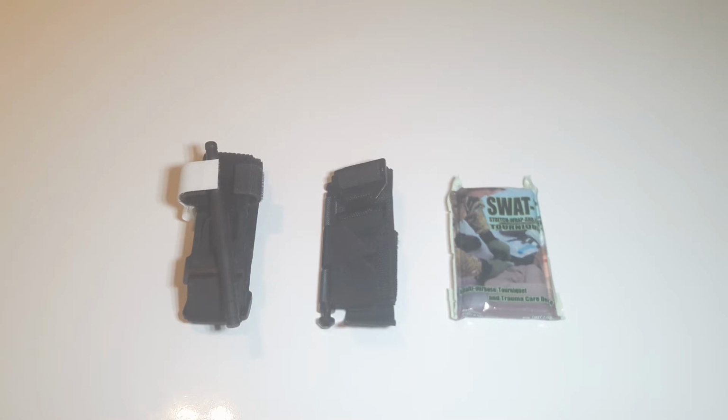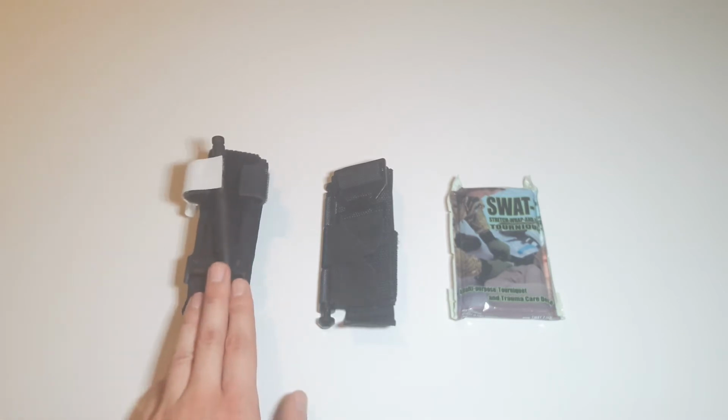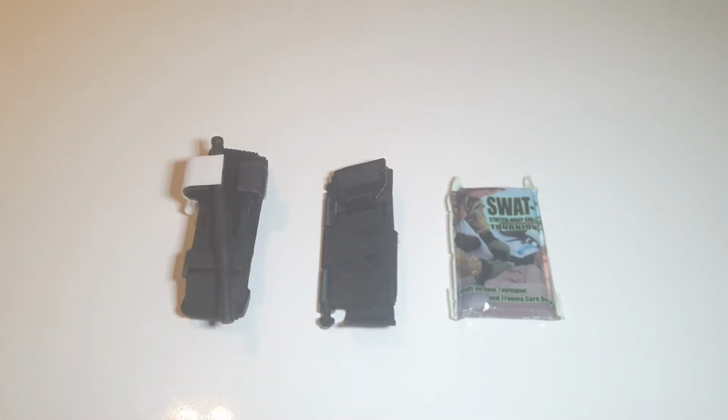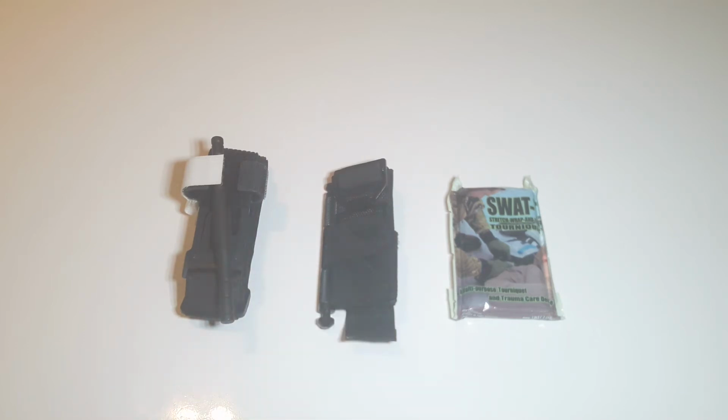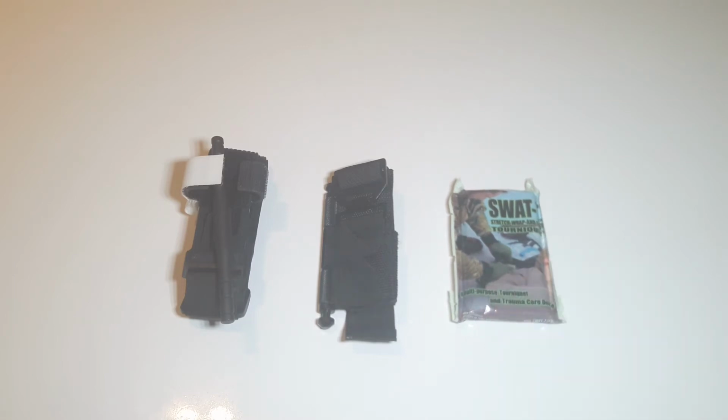So what I have here are 3 tourniquets: a Gen 6 Combat Application Tourniquet, also known as a CAT tourniquet by North American Rescue, the Special Operations Forces Tourniquet or SOF-T Wide version by TACMED Solutions, and the Swat-T Tourniquet by TEMS Solutions. Of these 3, the Committee on TCCC only recommends these 2 to be used in the field.